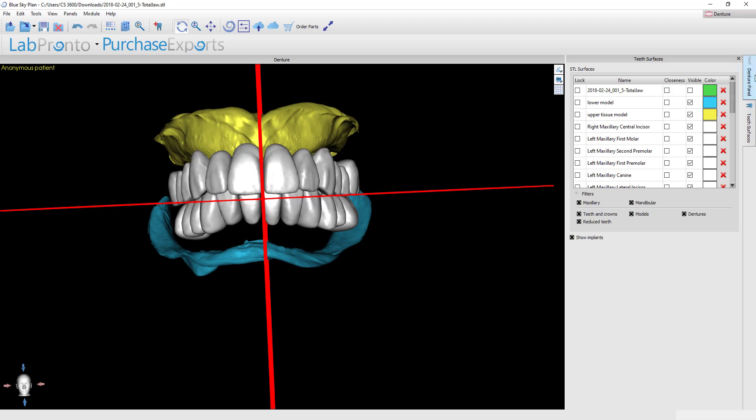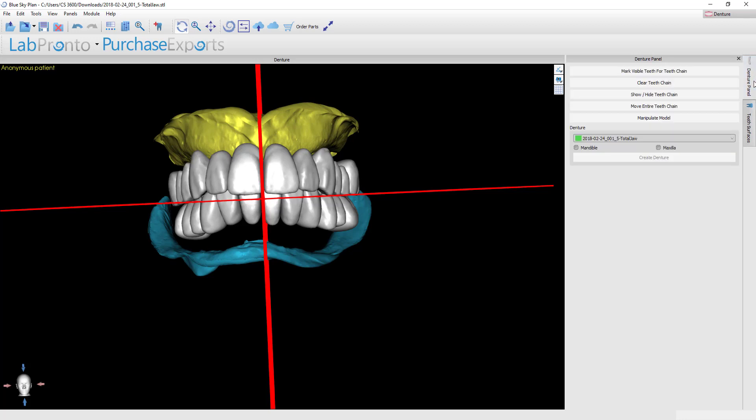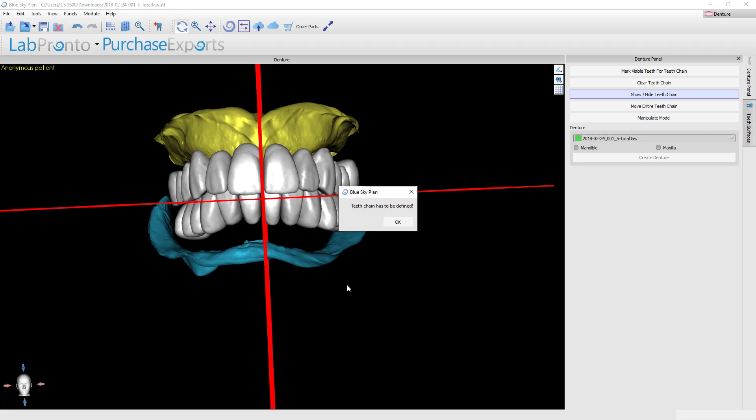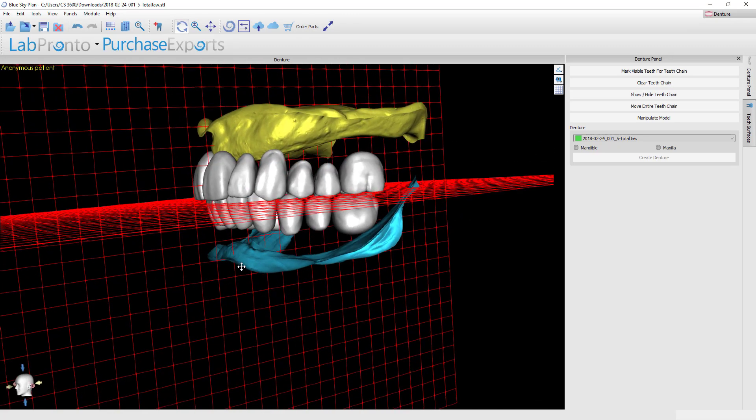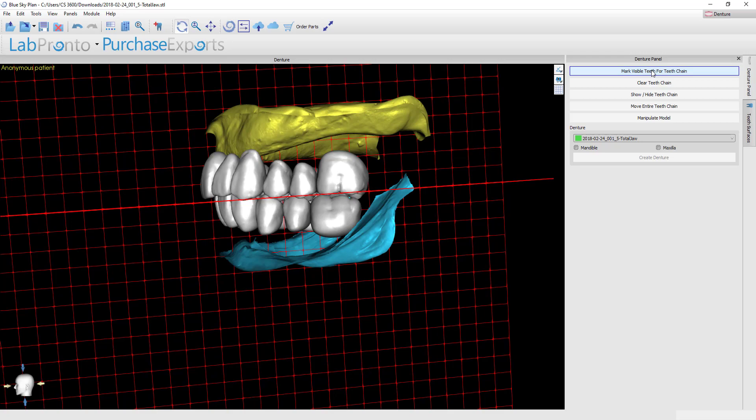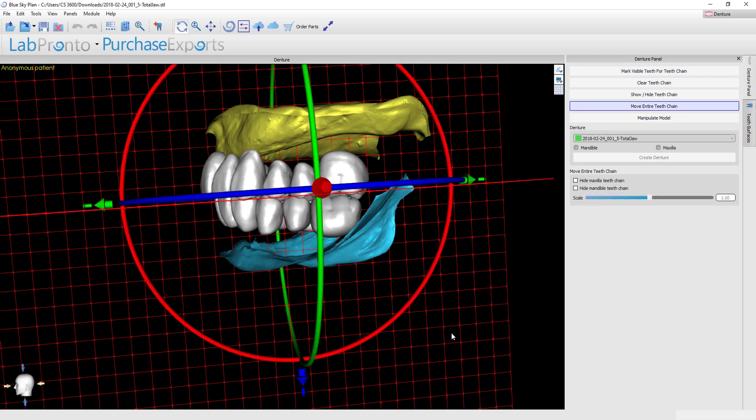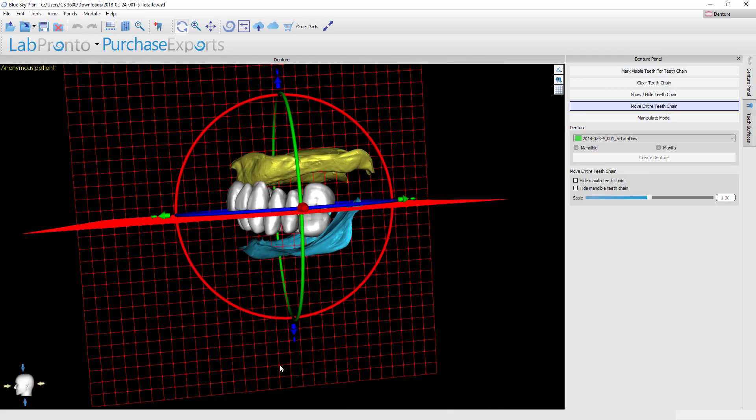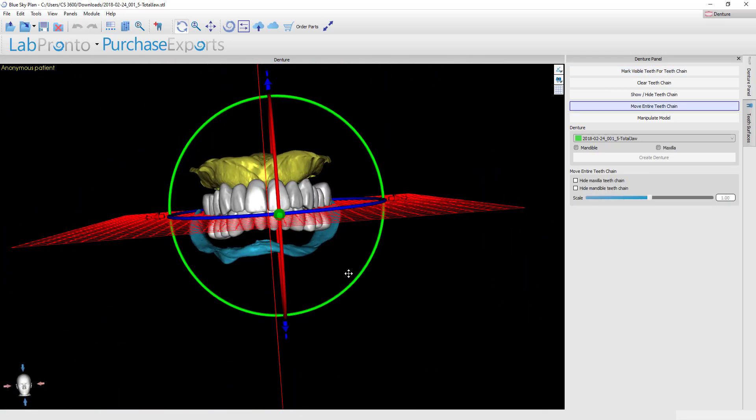I'll do that by going back to the denture design panel and what I want to do is hit the button that says show and hide tooth chain, but there's going to be an issue. In this particular case because I've deleted some of the teeth that messed up what we refer to as the tooth chain and we've got to reestablish that before we can proceed and move individual teeth. To redefine your tooth chain it's a very simple thing to do. You need to make sure all the teeth are visible and then simply come back up here and hit the button that says mark the visible teeth for chaining.